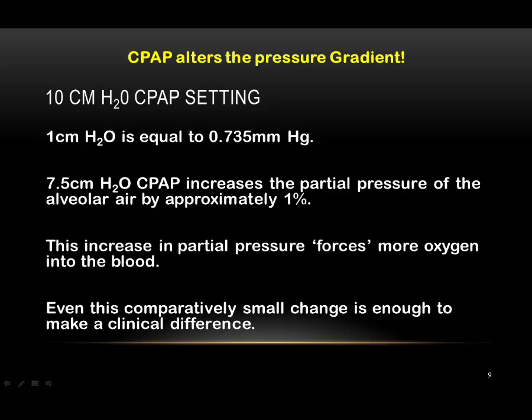Our CPAP settings are at 10 centimeters of water. That increases the partial pressure of air over 1%. This increase in partial pressure forces more oxygen into the blood. Even this comparatively small change is enough to make a clinical difference.